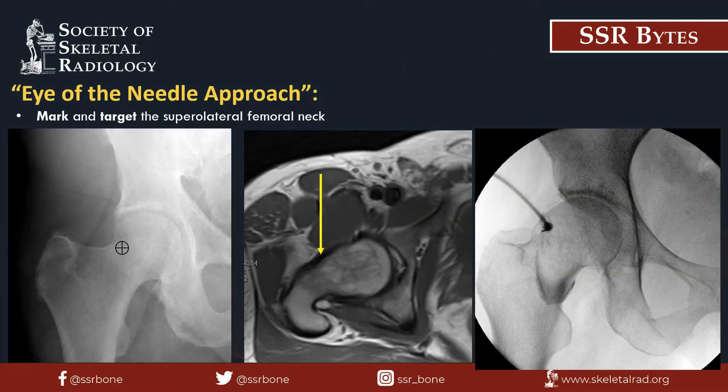The eye of the needle approach is one of two trajectories we can use when inserting the spinal needle onto the femoral neck. This technique entails marking the skin in the region of the superlateral aspect of the femoral neck, the same as our bony landmark. The needle will be inserted and directed in a straight down fashion onto the superlateral femoral neck. With this technique, you will ideally see the needle on end as demonstrated in the fluoroscopic image on the right.